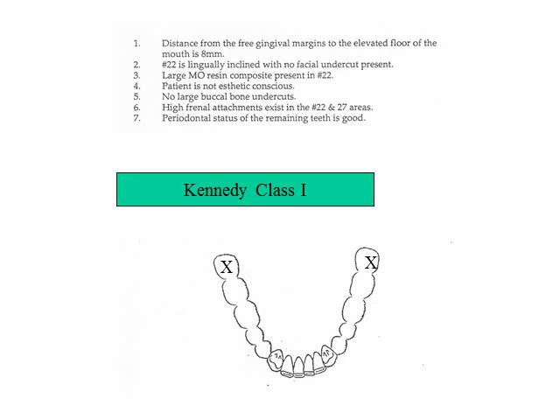Our first step is to obtain diagnostic casts of both arches. If teeth are to be retained in the maxillary arch, the casts should be accurately mounted. Surveying the mandibular cast is accomplished with findings as noted.